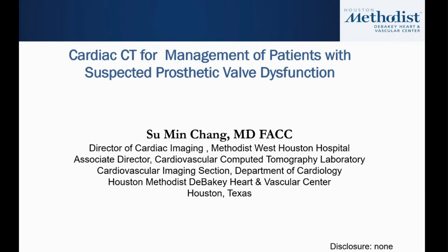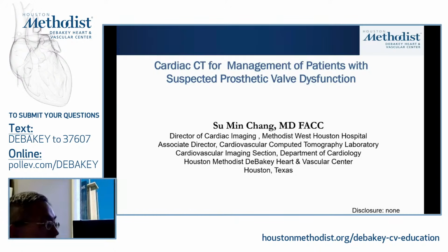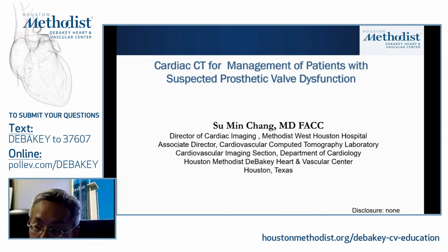Okay, there's been tremendous advances in CT, the role of CT for management of prosthetic valve. So I'm going to spend the next 15, 20 minutes on a quick overview of what CT can do, because for more detailed discussion, I need to spend at least an hour.